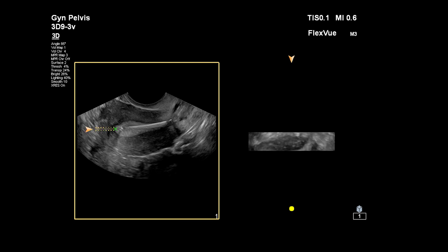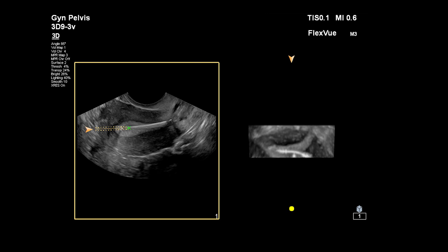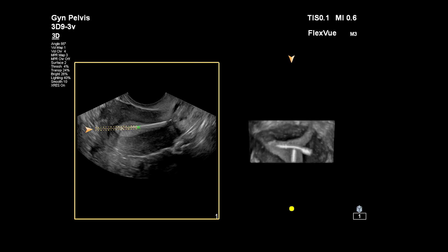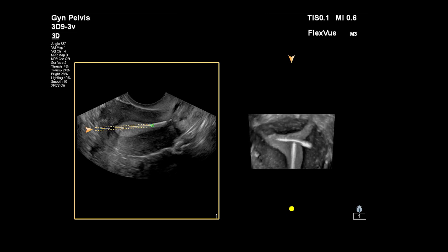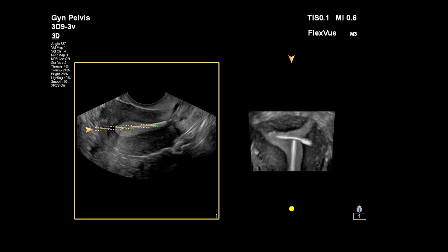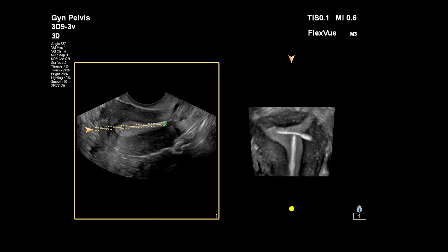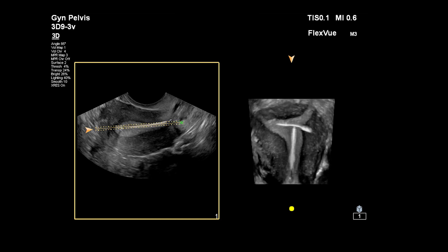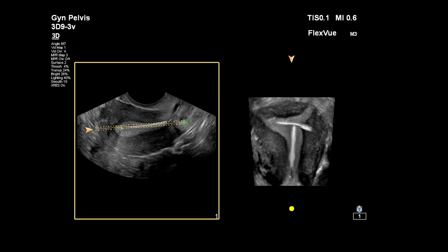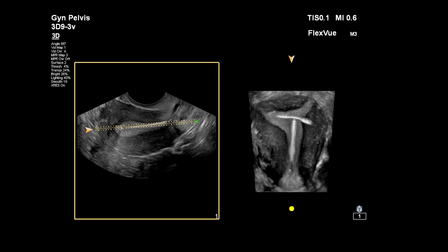As we cut through the longitudinal image of the uterus, the IUD appears, the endometrium appears, and the myometrium also in a perfect coronal plane.